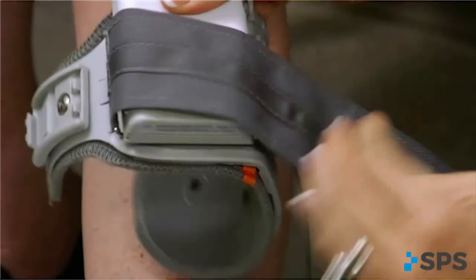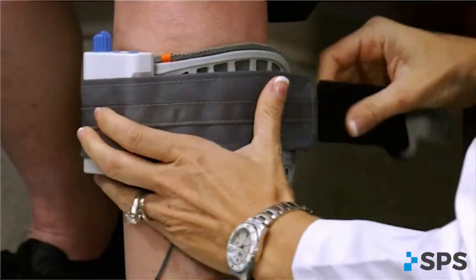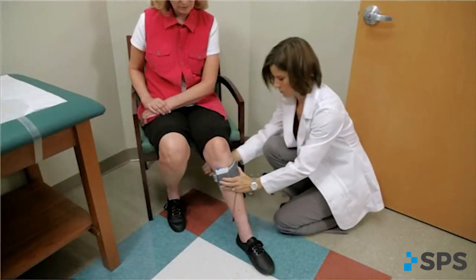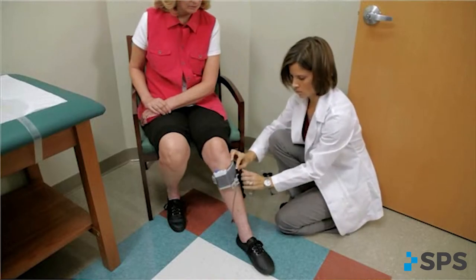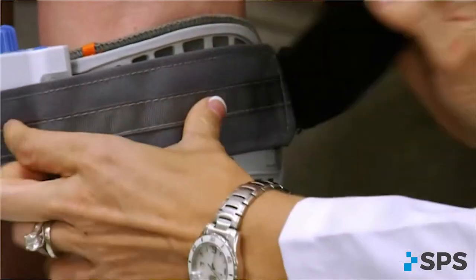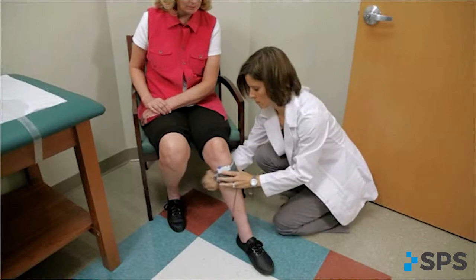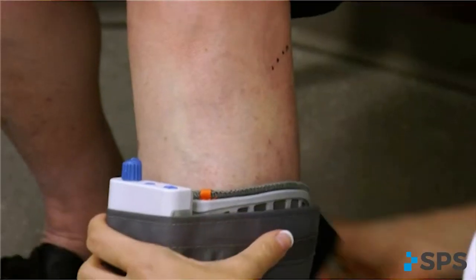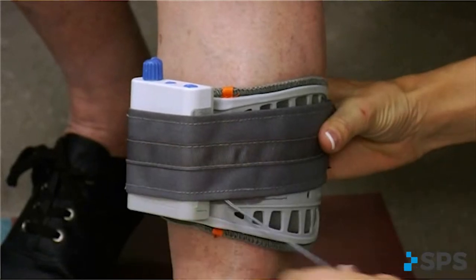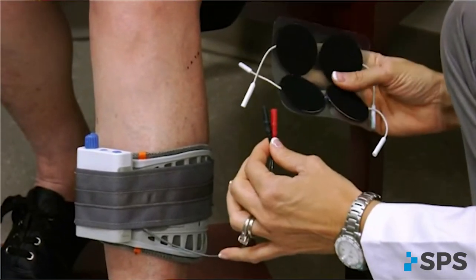Attach the walk aid to the cuff on the anteromedial flattened area. Before placing the electrodes on the leg, it is important to size the cuff to fit the patient. Identify the appropriate cuff size and make adjustments to the black strap as needed to ensure a snug fit when the cuff is buckled. Position the cuff around the mid-calf region and secure in place below the potential electrode sites. This places the walk aid in a convenient location to hook up the electrodes and frees your hands to adjust the electrode placement.